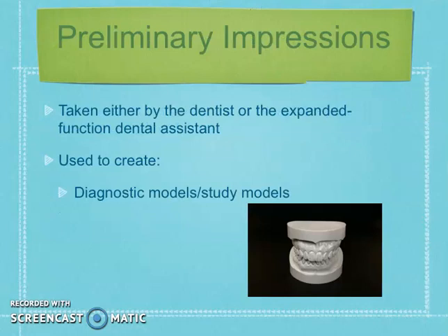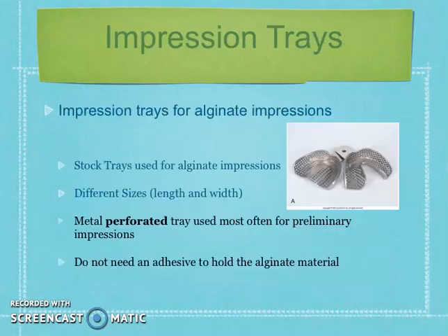So preliminary impressions can be taken by the dentist or the expanded dental assistant or a DA2 or CDA. They're used to create diagnostic models. Most people refer to them as study models. The impression trays are a stock tray. They come in different sizes, lengths, and widths.